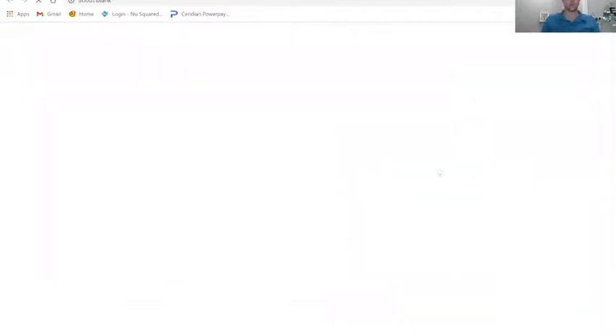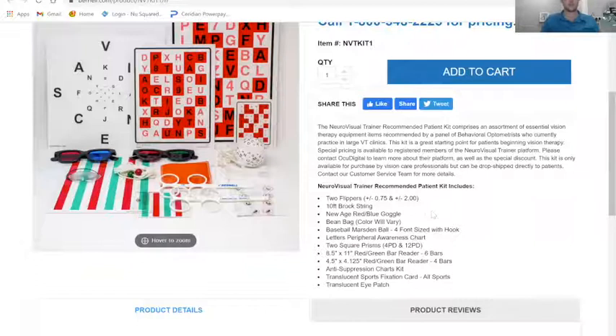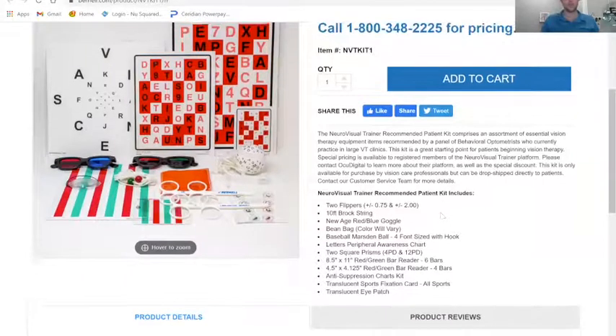Within their kit — and it's a quick order through Burnell — you get two flippers: a 0.75 and a 2.0. The reason I like those numbers is the additive properties. You can have a 0.75, a 1.25, a 2.0, and a 2.75. So you can get a nice range of flippers just by having two — you kind of get four.